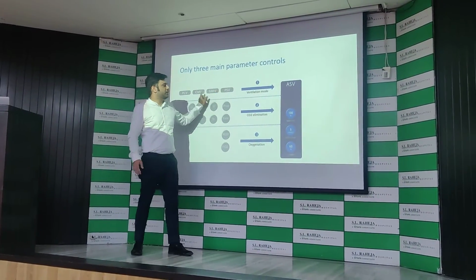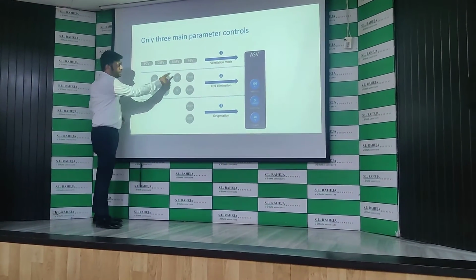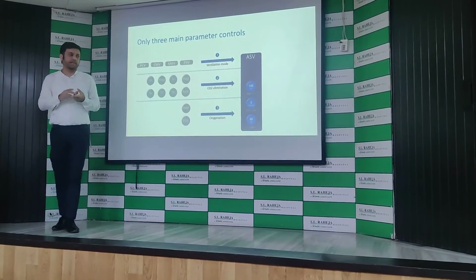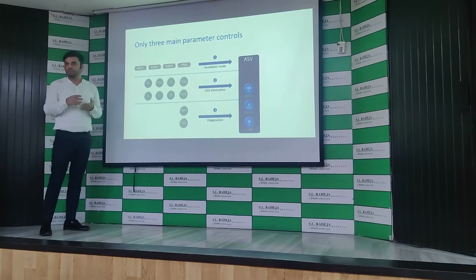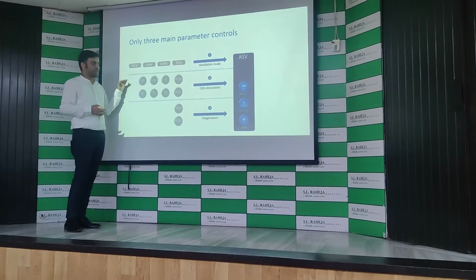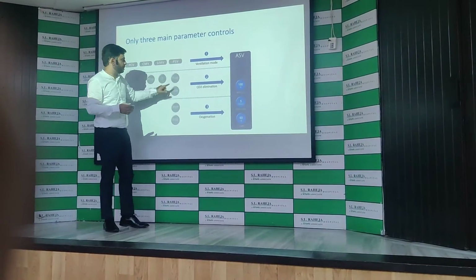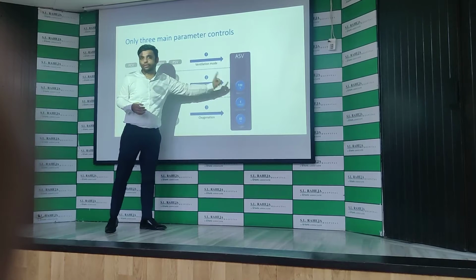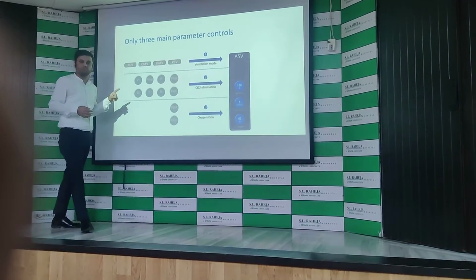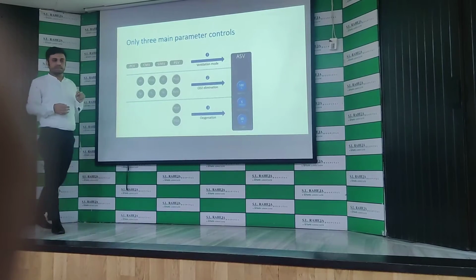Now for all this we have one ventilator mode, which is ASV. All these parameters, specifically the volume and the rate and the inspiratory time or the I ratio that we set, ultimately help us eliminate the CO2. So for all these modes, all these parameters, we are just setting one parameter, which is the percentage minute ventilation, and this is ultimately going to help us with CO2 elimination.